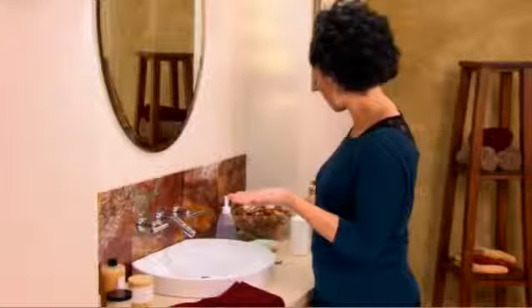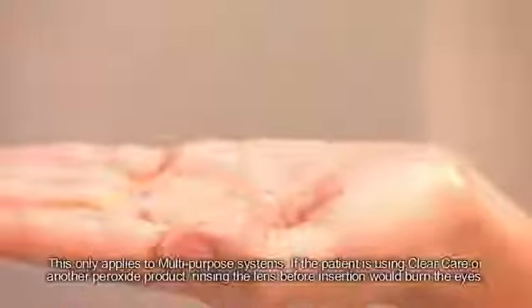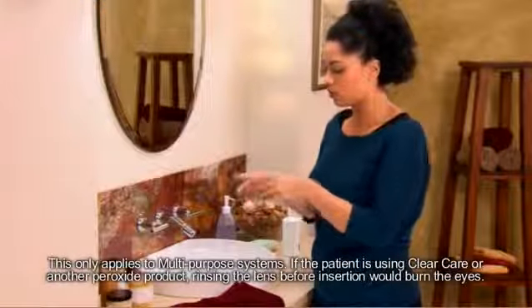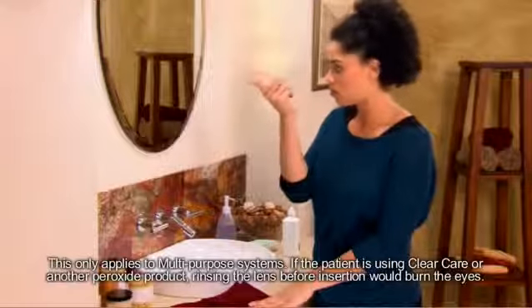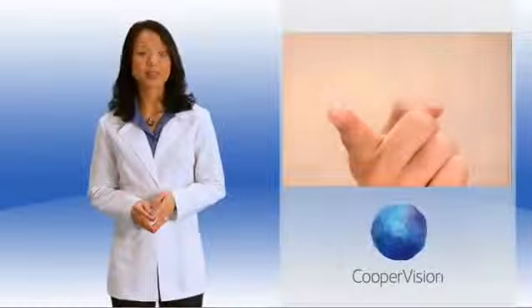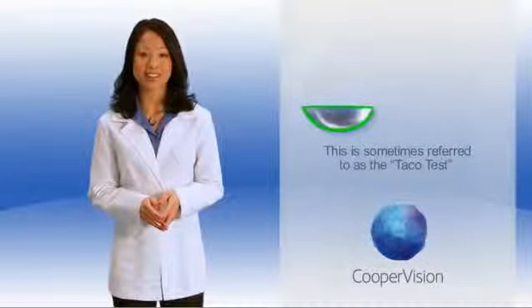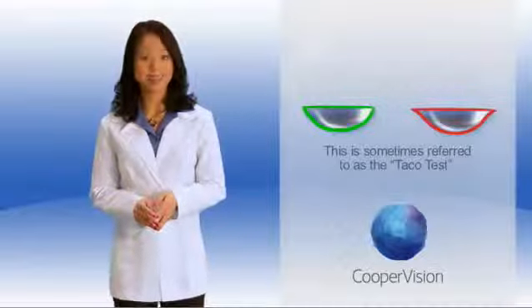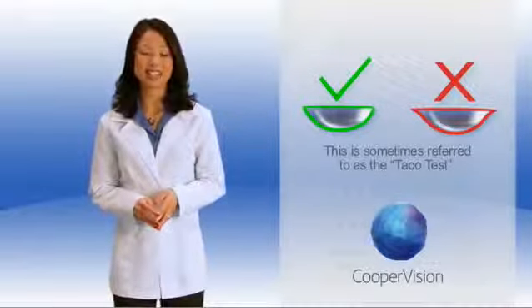Remove the contact lens from its case or blister and place it in your left palm. Rinse the contact lens with the solution recommended by your eye care practitioner. Once you're finished rinsing, examine the lens for any particles, deposits, or tears. Place your contact lens cup-side up on the tip of your dry index finger on your right hand. Make sure the lens is right-side out — you should see the lens edge almost straight across. If the lens is inside out, the lens edges will bow out slightly. If this is the case, make sure to reverse the lens so it's right-side up.